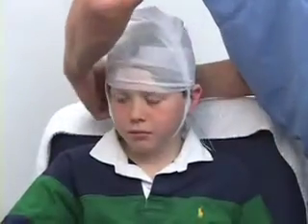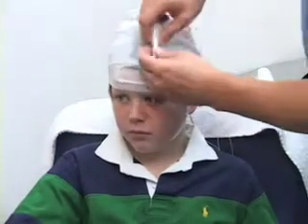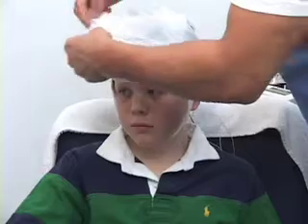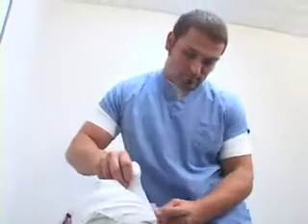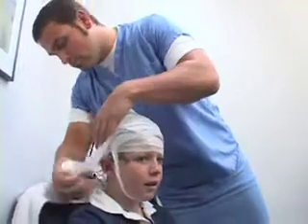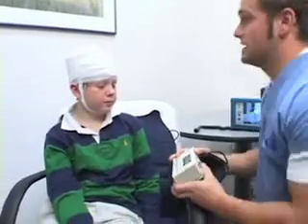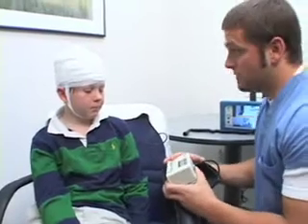The electrodes are designed to pick up tiny electrical changes, which are produced by the activity of the nerve cells in the brain. Once your electrodes have been attached, your head is wrapped with gauze to hold the electrodes, wires, and amplifier in position. Depending on the orders of your physician, your test may be video recorded.